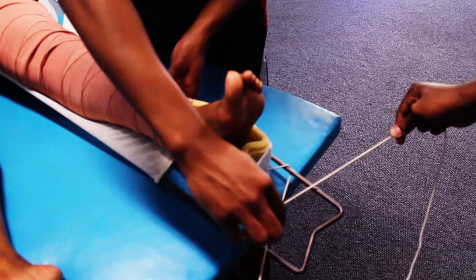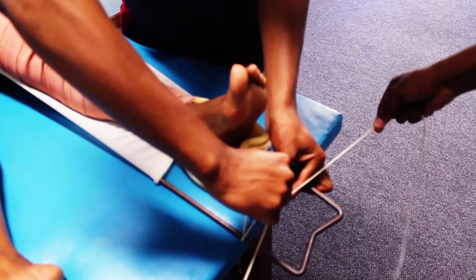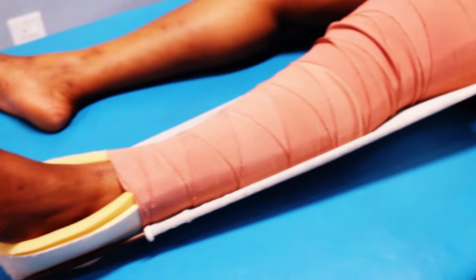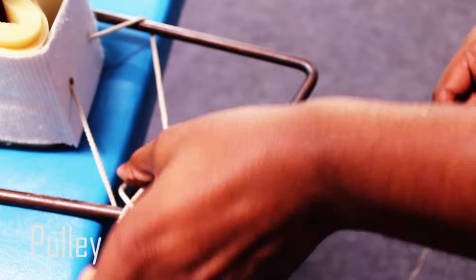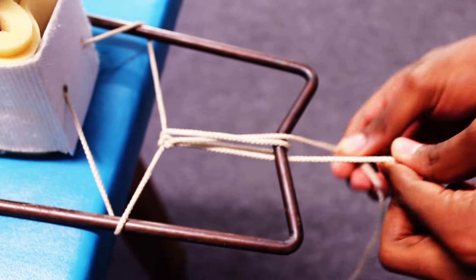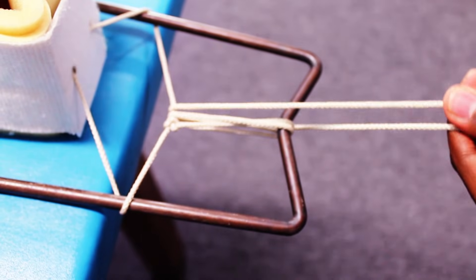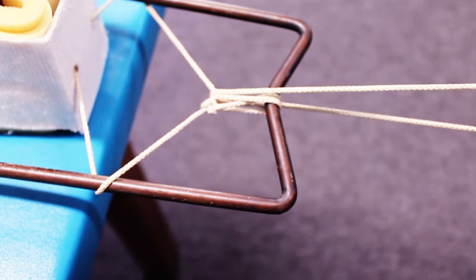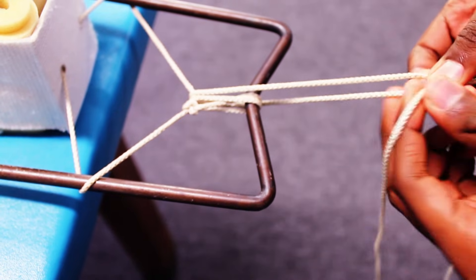Your assistant can help you to secure the knot. At this point your traction should look like this. Next, you want to create a pulley system that allows you to either increase or decrease traction according to what's best for your patient. You can secure the pulley with any regular knot.